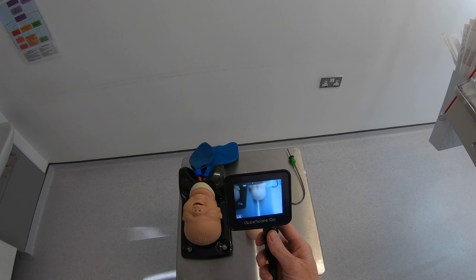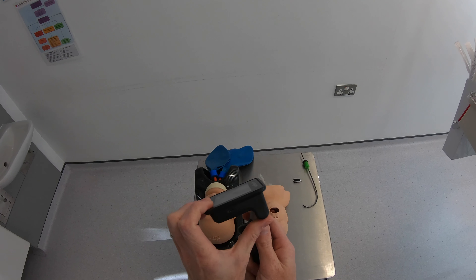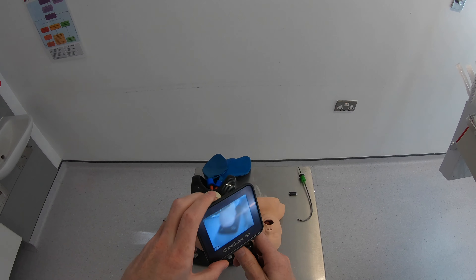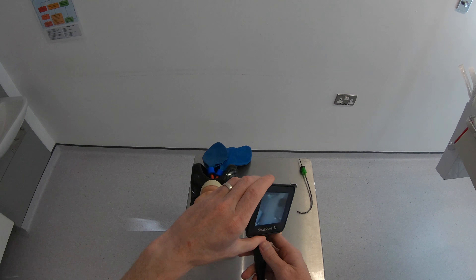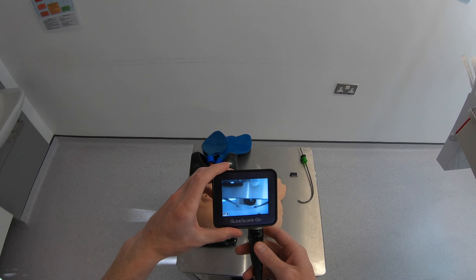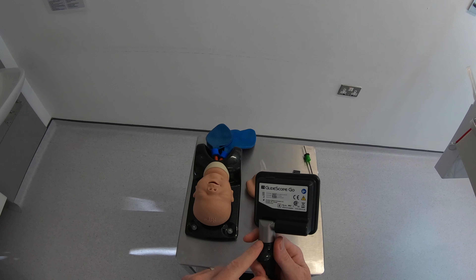We can see at the bottom left corner of the screen the time — 2 hours and 28 minutes of battery left to do the intubation. The device has quite a lot of viewing angles, so you should be able to get yourself in a good position to see the screen.